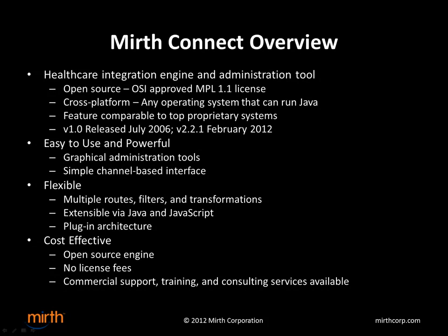It's been shown in studies that Mirth Connect is feature comparable to all the top proprietary systems, and it's been around for quite a while now. Version 1.0 we first released in July of 2006, and we've released new versions steadily since then, with 2.2.1 coming in February of 2012.